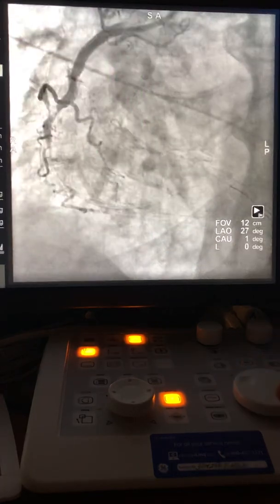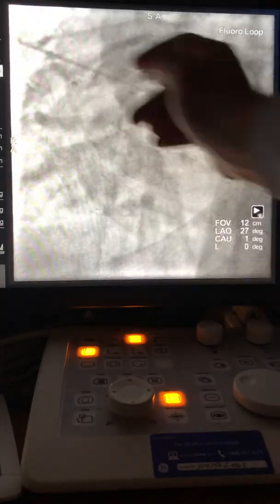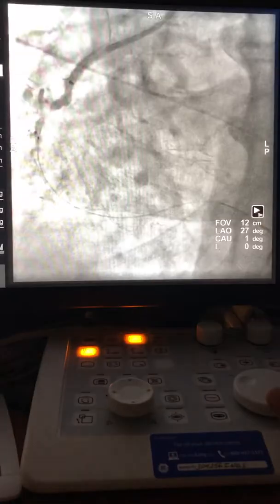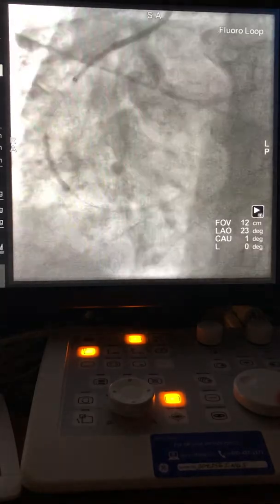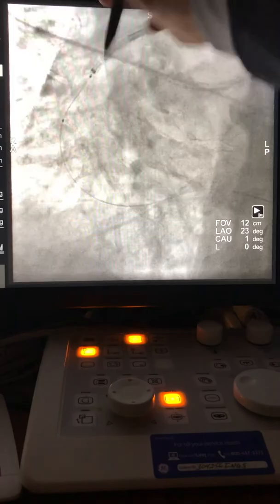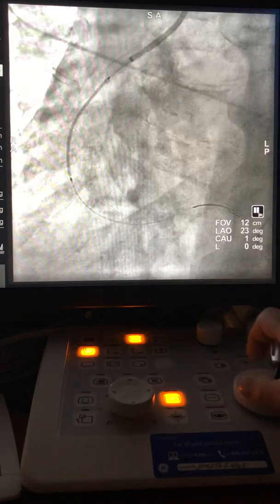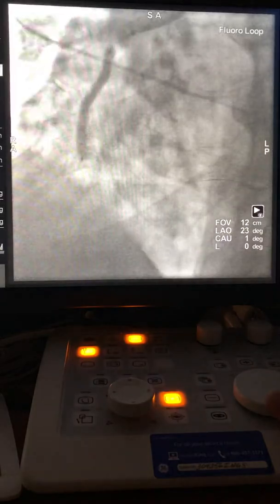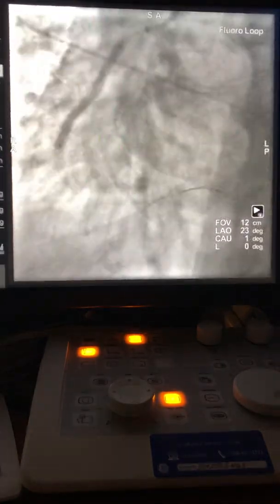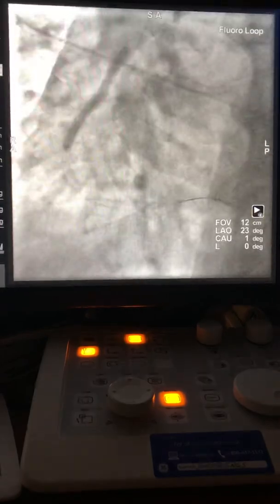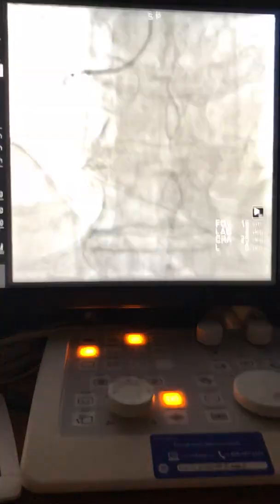Now advance the 1.25 or 1.5 balloon — it went through. Inflate all over, then upgrade the balloon to 2.0. Make sure the guide liner tip is always here. Then stent the area, overlapping with the prior stent at high pressure. Pull the balloon, inflate the overlap area also at high pressure. Pull the guide, then readvance the guide liner.